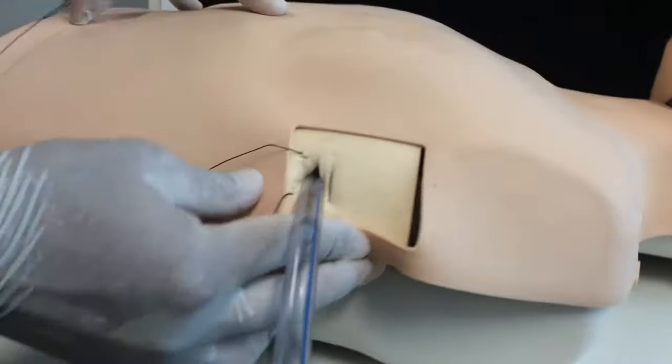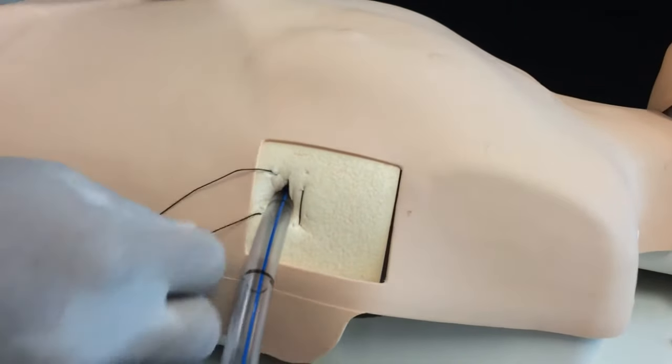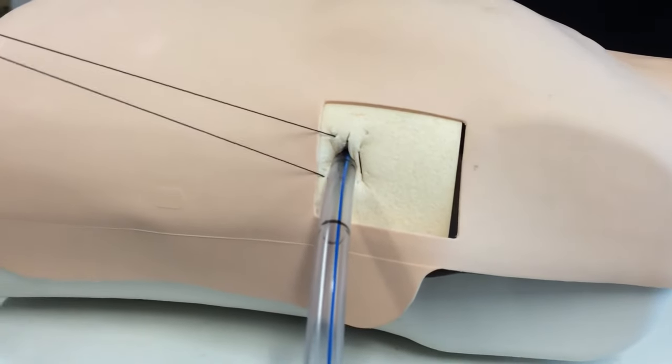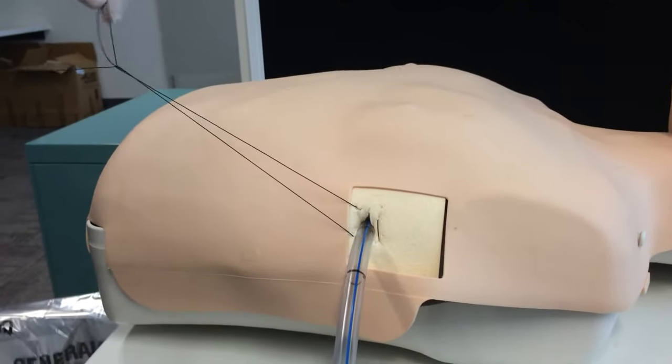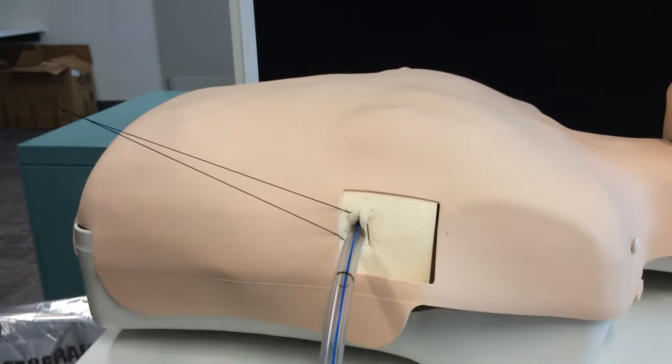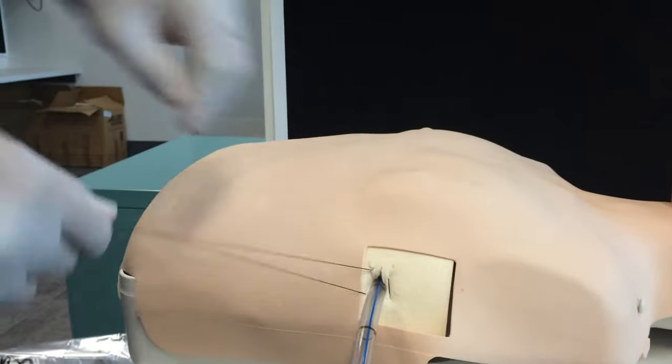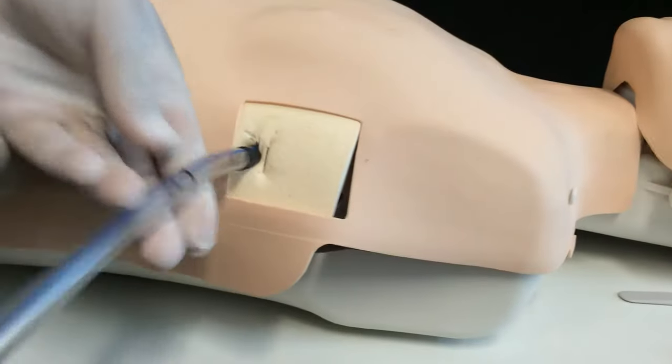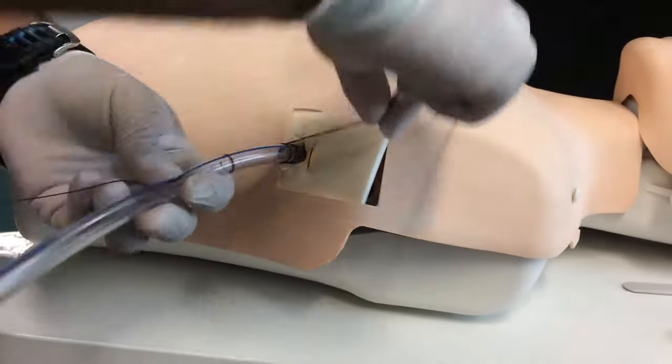So I put a horizontal mattress suturing and gone through over and around, and what you do is then you secure the knot in. You wrap this tightly around the drain until the knot is at the drain.